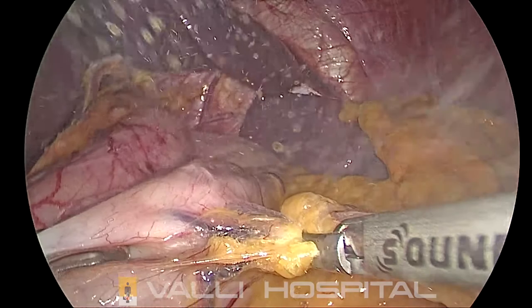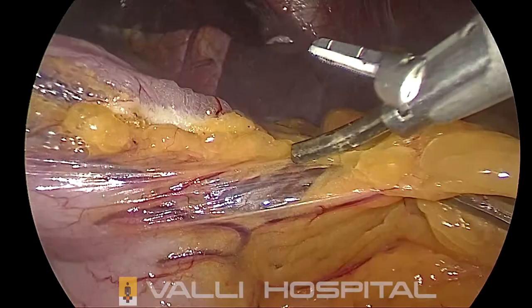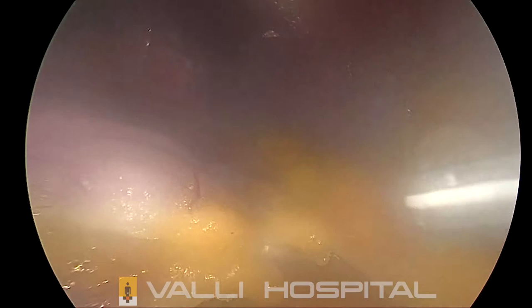Here, you should not go closer to the stomach. In sleeve gastrectomy, we hug the stomach and go. Here, you have to keep at least 1 to 1.5 centimeter away from the stomach because we are going to keep the stomach here. In sleeve gastrectomy, we are going to remove the stomach. So it's very important you go 1 to 2 centimeter away from the stomach. Then again, migrate your instrument.